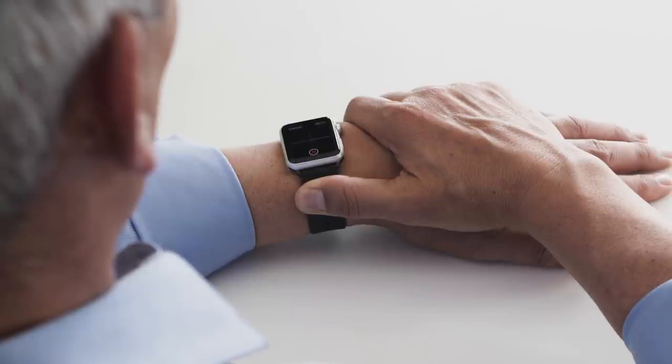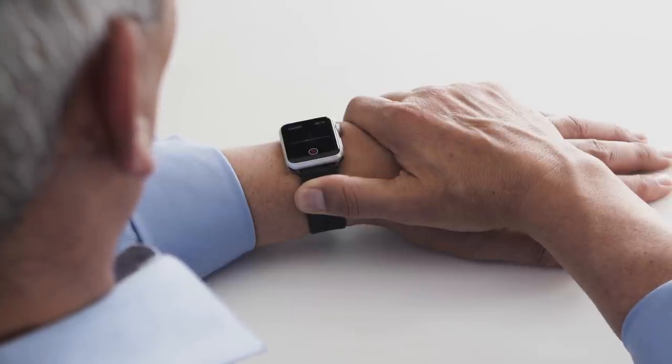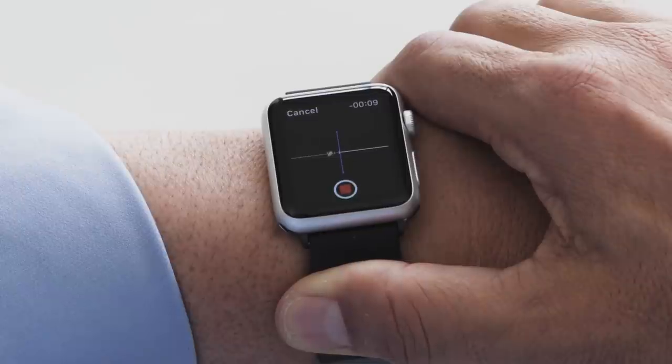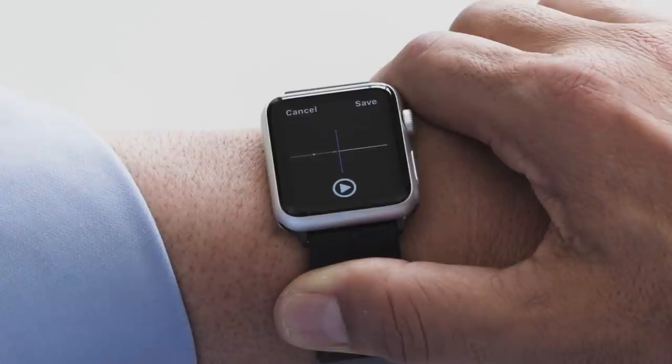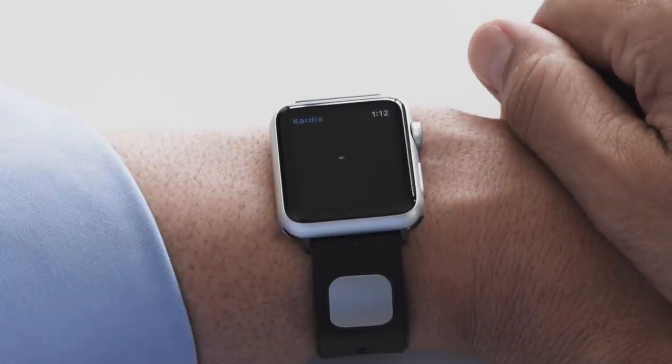While KardiaBand is recording your ECG, you can speak your symptoms to go along with your recording. Your voice will register on the Apple Watch as you speak. At the end of the recording, you can save or cancel your ECG. That's how easy it is to record an ECG — anytime, anywhere.